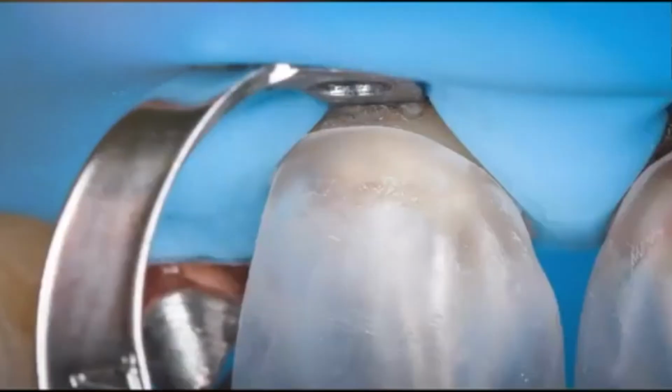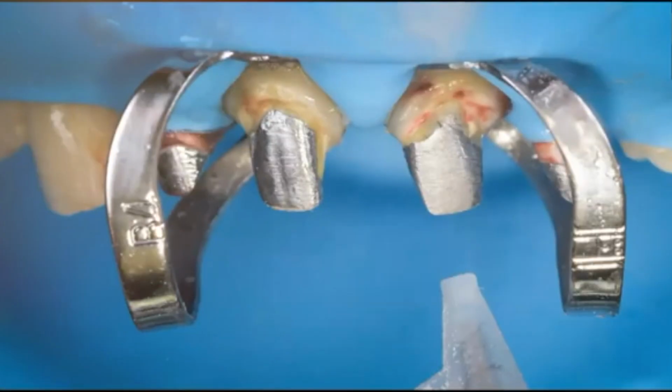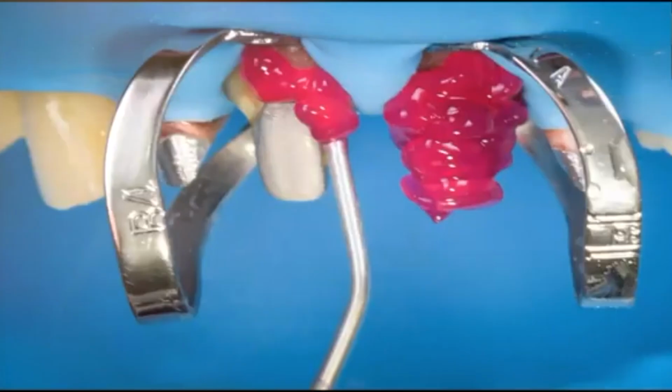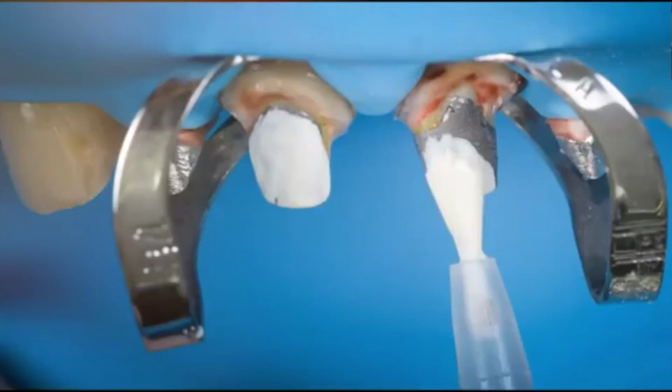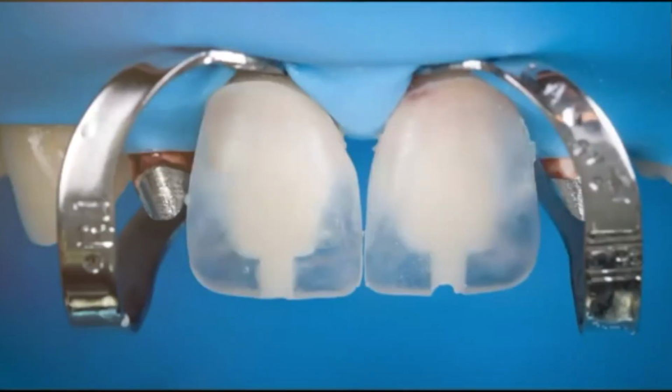This has amazing fit, and you can also do at the same time the transparent one and also the provisional. So you can do this before you do the procedure and finish in one session. And then when I get this, I'm going to sandblast, etch, silane, the bonding process. Then I take like an opaquer, something I found from the lab, resin based. I block the metal, and then I fill in the copings inside with warm opaque composite, like dentin composite, and you just put it in on the chamfer and you cure.